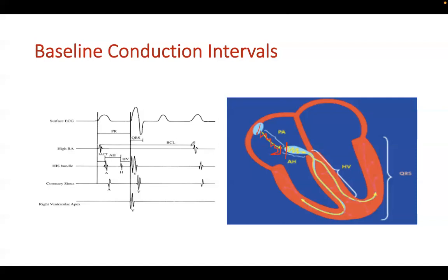Okay, but this has to be routine and quick. Yeah, it has to be done quickly. It takes 5 minutes to measure these. If it's routine and you do it quickly, then obviously it will not take so much time.